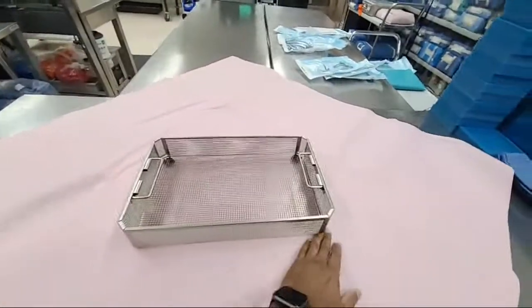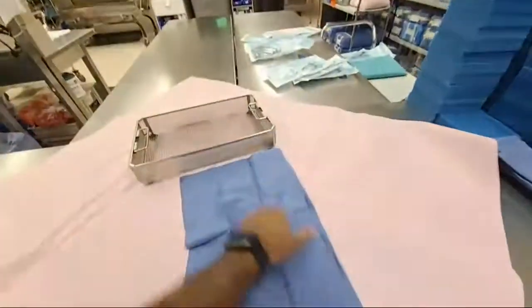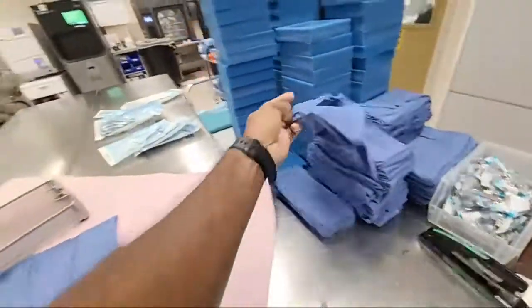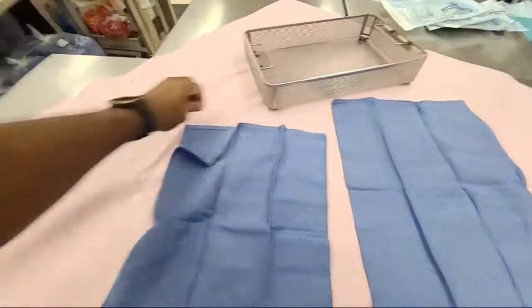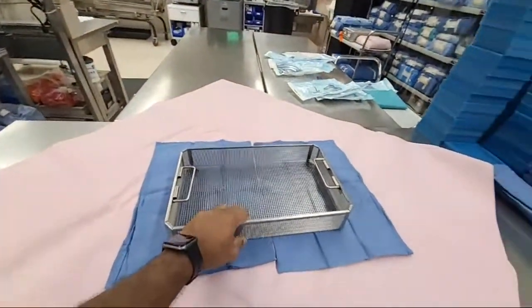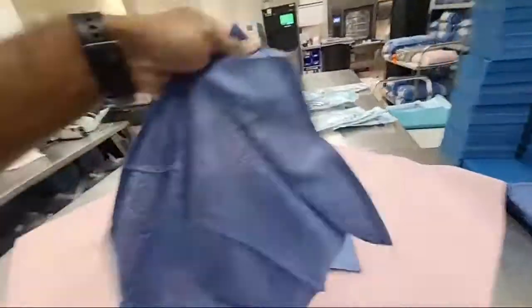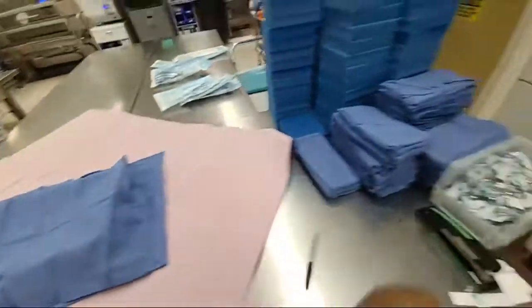So kind of find the middle. If we need some padding on the bottom, we can take some, because these things sometimes are on top of each other, and the corners can tear through. Again, it should not be accepted for surgery if the lining is torn, because the item may no longer be sterile. And we don't want to take that risk with a person's life. There should be some CIs inside the tray if you need to cover it. You normally do. And cover it again. I've never done this one-handed, so this is interesting.